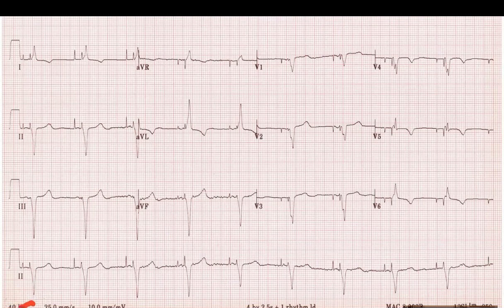So that's one. Could we assess atrial sensing? If I compare the last beat to the QRS of the others above, I think it is pacing in before the QRS, and I don't see any P wave. This one definitely looks different. In all the remaining previous ones, you could see some atrial activity. This is the only one where I don't see any atrial activity. That's why I think there is some loss of capture here.